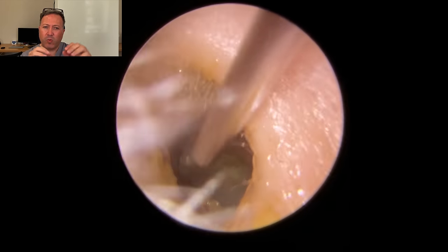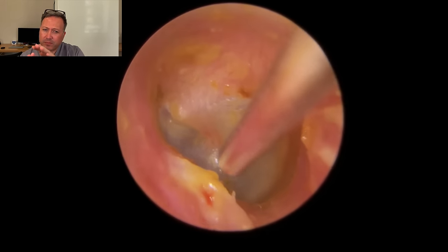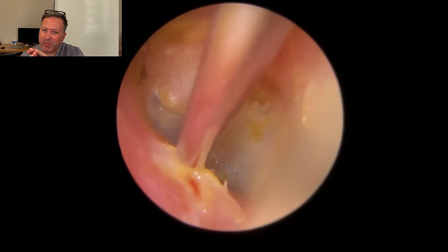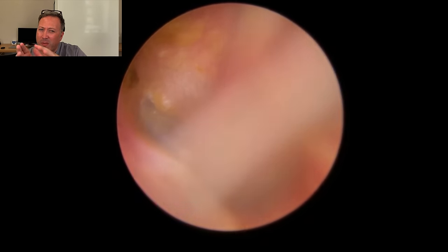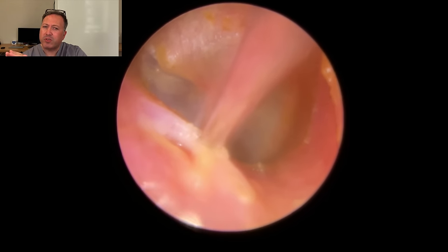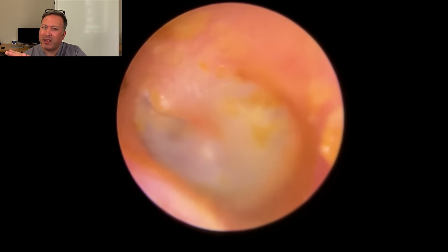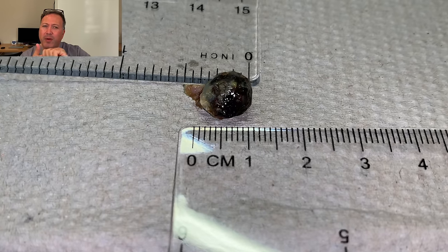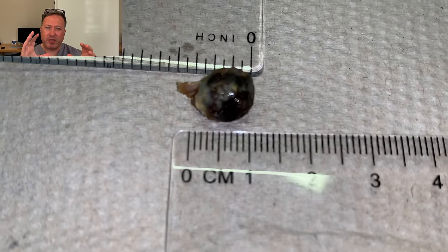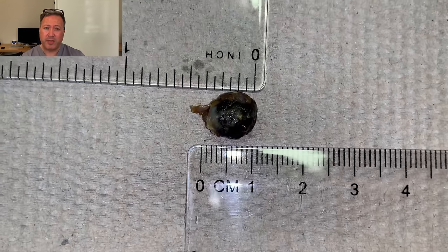Now what you'll see, there's where it's been rubbing here, look, on the canal. So I'm just going to try and tidy up some of the skin here, but see the really red spot there? That's where the wax has been rubbing back and forth. So it's almost formed like a little blister that's popped. I'm going to just see if it'll come away easily, but if not, I'm going to leave that there to heal itself. This is the piece that we removed. You can see here where we just had half an inch, so a centimeter across. Really quite a thick, hard piece of wax here.